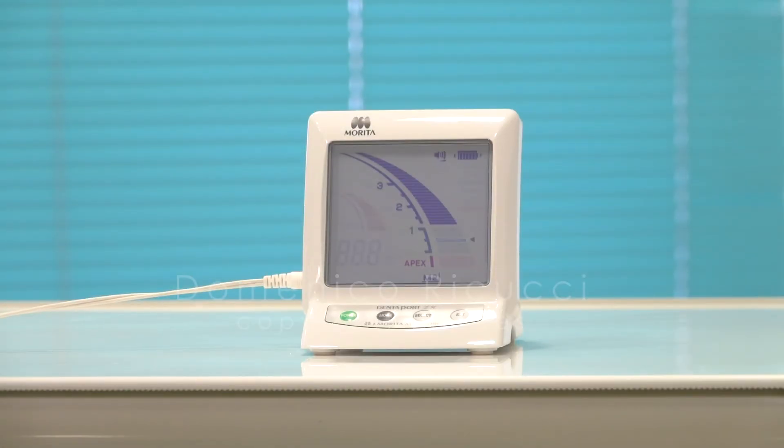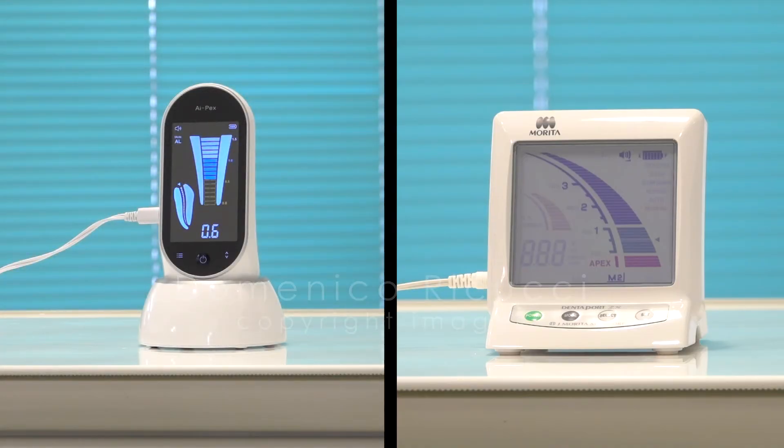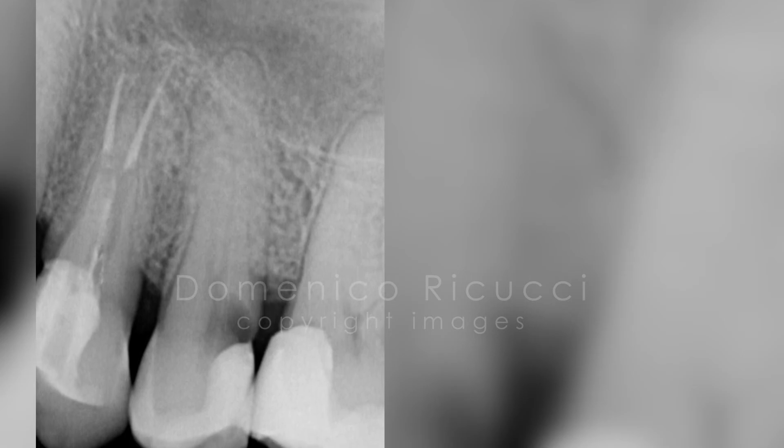Finally, the instrument was inserted until the end of the pink scale with Morita and the distance recorded. This was then inserted at the same depth and the measurement done with the Woodpecker. Woodpecker gave the measurement of minus 3. Based on this calibration, the Woodpecker device was used in some clinical cases. Here you have a couple of examples.